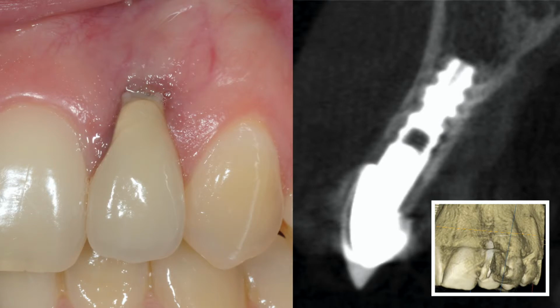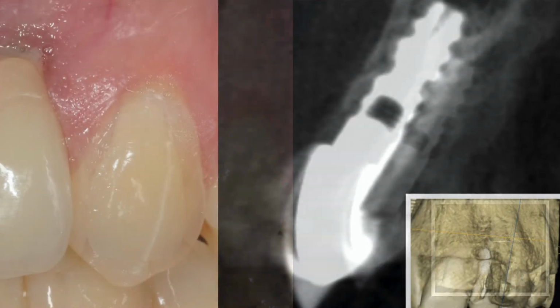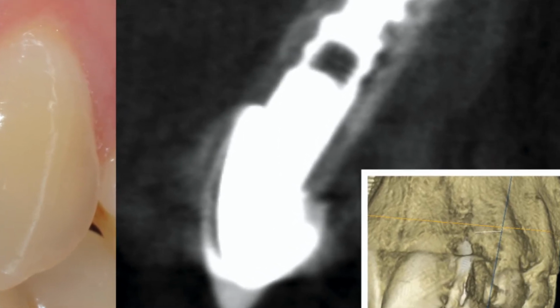So this is the critical part, and I want you to see the emergence profile and contour of not only the restoration, but the shared crown and abutment, both sharing the emergence profile. And as Hamid is showing you, right there is the critical over-contour of the restoration, because the implant is placed so shallow. That's critical.